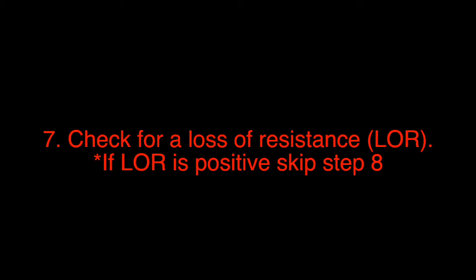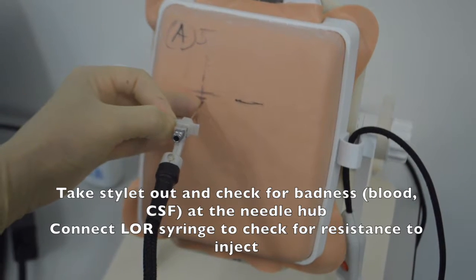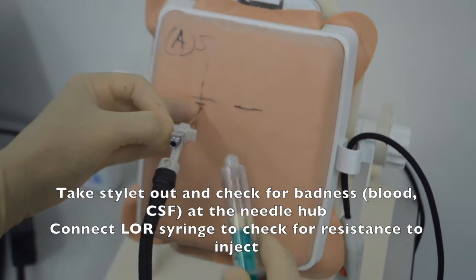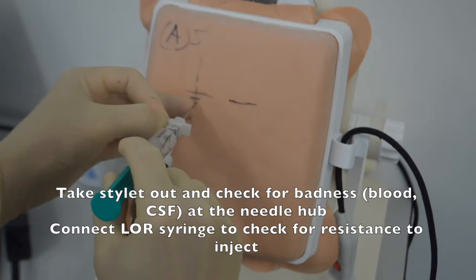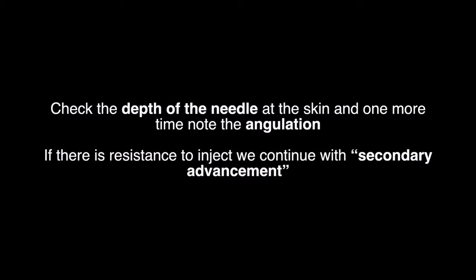Step 7: Check for a loss of resistance. If loss of resistance is positive, skip Step 8. Take the stylet out and check for badness at the needle hub. Connect the loss of resistance syringe to check for resistance to inject. Be sure to check the depth of the needle at the skin and note the angulation one more time. If there is resistance to inject, we continue with secondary advancement.